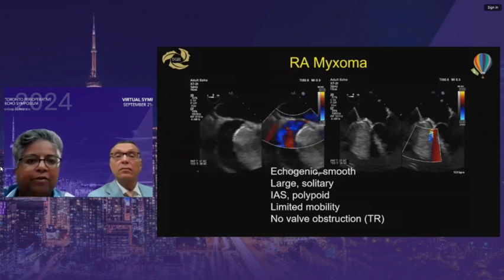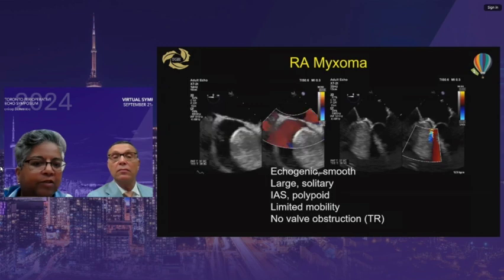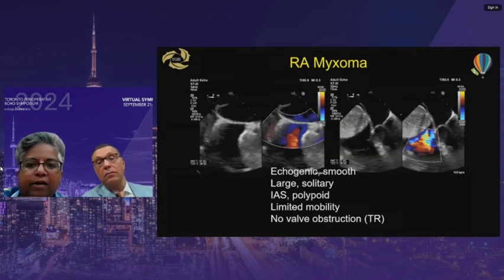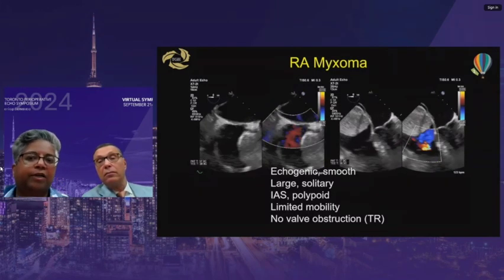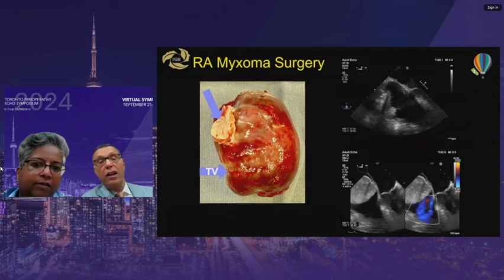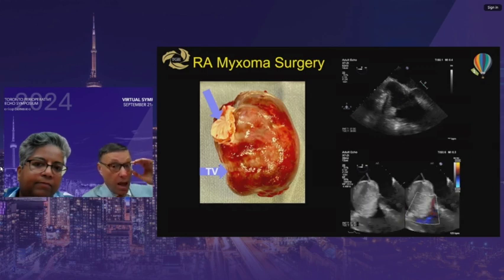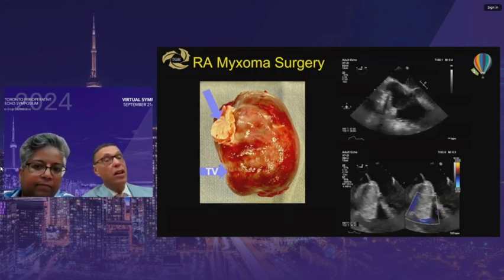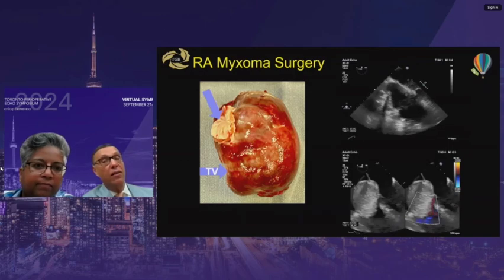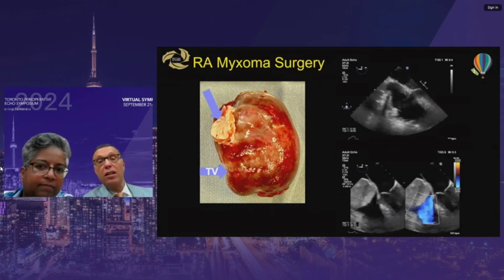This is a right atrial myxoma — pedunculated, sitting off the interatrial septum, smooth, large, and solitary with limited mobility. It's causing some tricuspid regurgitation rather than significant obstruction. An important behavioral clue: myxomas typically arise from the interatrial septum — when a tumor arises from the free wall instead, that suggests it may not be a myxoma. The post-op image shows the tricuspid annulus was tightened. You can see how the annulus was stretched by the gradually growing tumor.